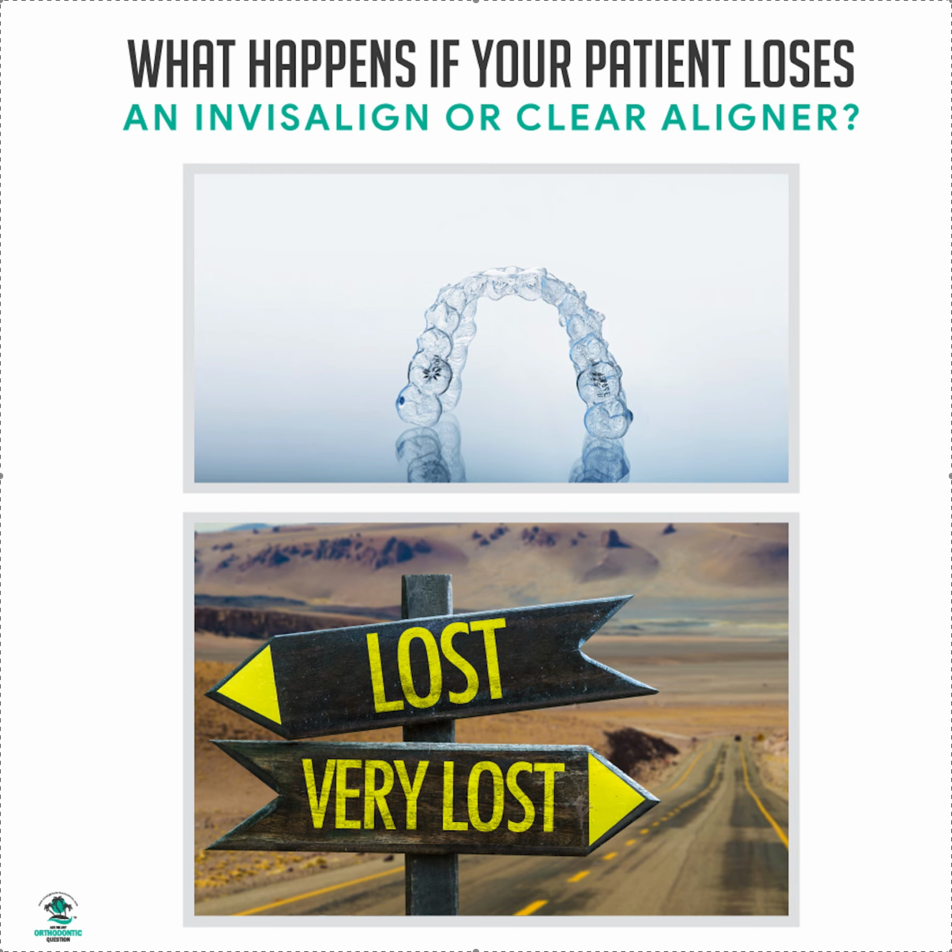If you end up picking aligner 19, then you're going to have to go into the portal, and I do have a video on this, how to order an Invisalign lost aligner. It's a step-by-step process, shows you what buttons to click. Remember, there is a fee for this. I don't know what it is. Last time I ordered, maybe it was 10 plus shipping per aligner, but it might be more now. It probably is. So just remember, there is a fee for this.